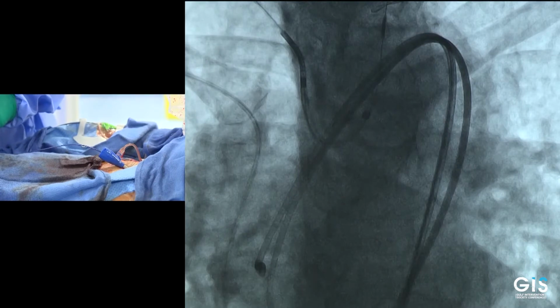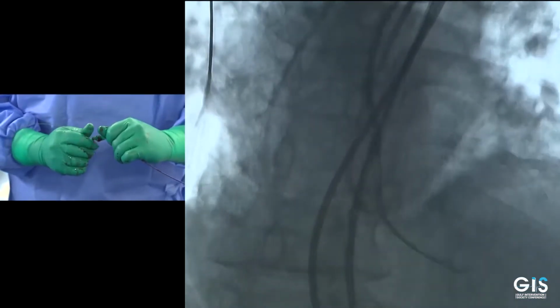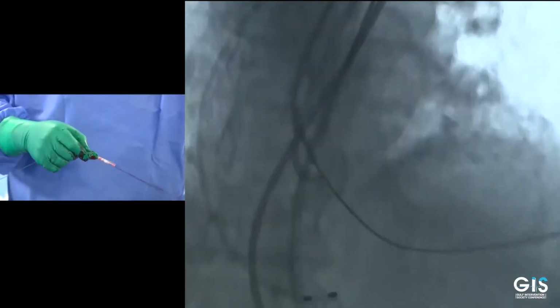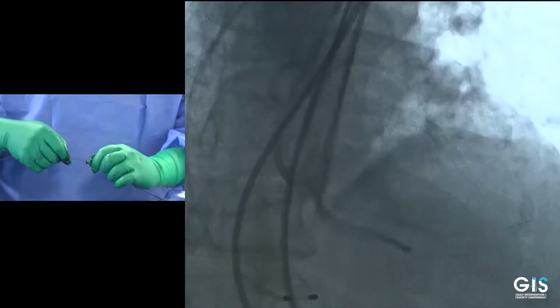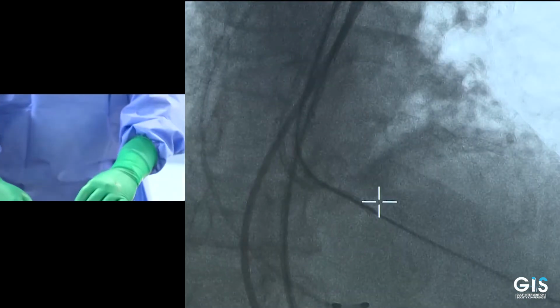In order to cross the valve, different wires can be used. I personally prefer to use a straight tip wire. There we go. So sometimes we will try to get the wire to curve in a better position. So I tend to bring it back and try to get it into a curve in those situations. Okay, so here we're having a good position.